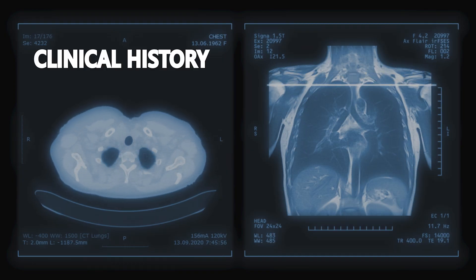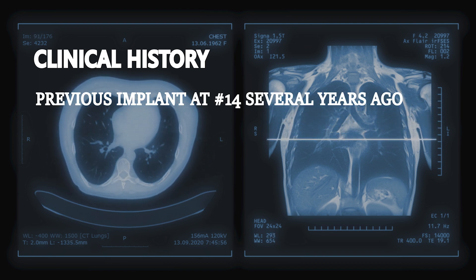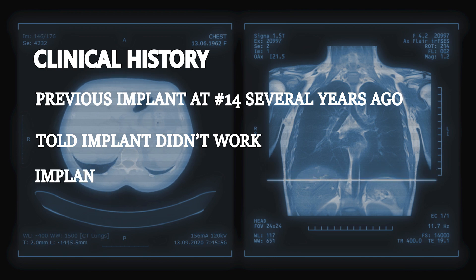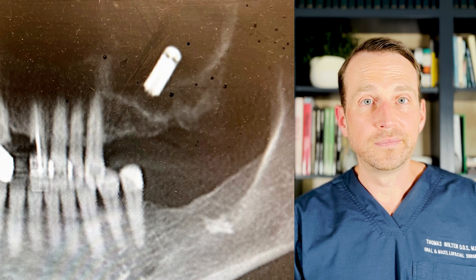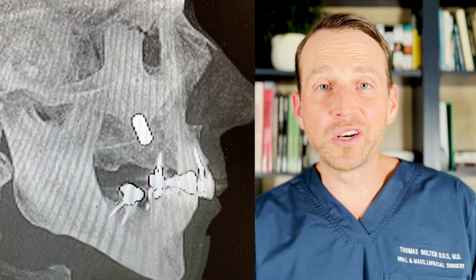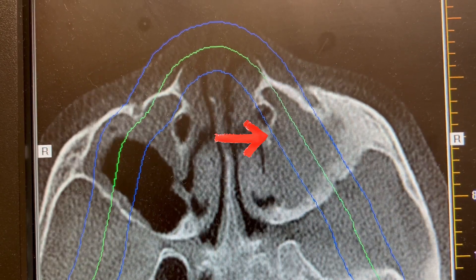This is where it gets a little bad. This patient tells me that she had an implant placed a few years ago at an outside office. She was told that the implant didn't work and that they had to remove it. Well, they were right that it didn't work, but clearly removing it didn't happen. It stuck up in her sinus and she has no idea. In addition, you can see that the sinus is very cloudy in this area, suggesting a chronic infectious process.